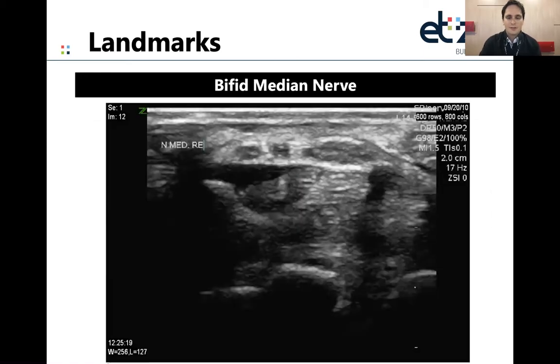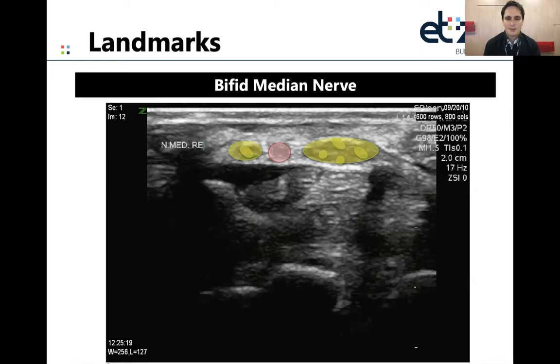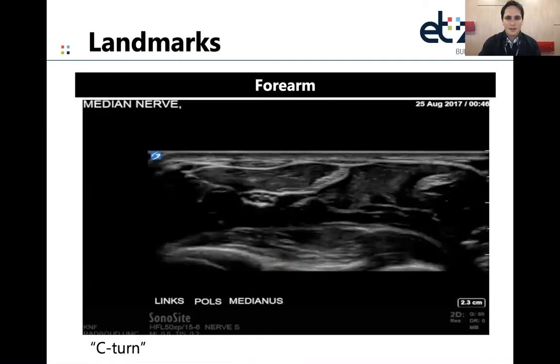When imaging the median nerve at the wrist, you may encounter a bifid median nerve — an anatomical variation in which a persistent artery divides the nerve into two segments. You can use color Doppler to visualize this artery. If you measure a bifid median nerve, you should add the cross-sectional area of both segments, and when applying reference values you should add one millimeter to the cutoff value.